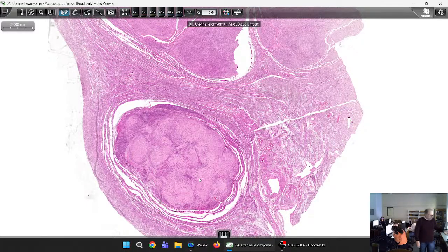or you can have this blood irrespective of the menstrual cycle. So this is why when leiomyomas are multiple, as here, because you see there are many nodules of smooth muscle cells, you're thinking of either resecting the leiomyomas on their own, and here you have to say if it is within the wall, if it is right under the mucosa of the endometrium, or if it is near the serosa, and you have to resect them because they may become big enough and cause all these problems by compression.